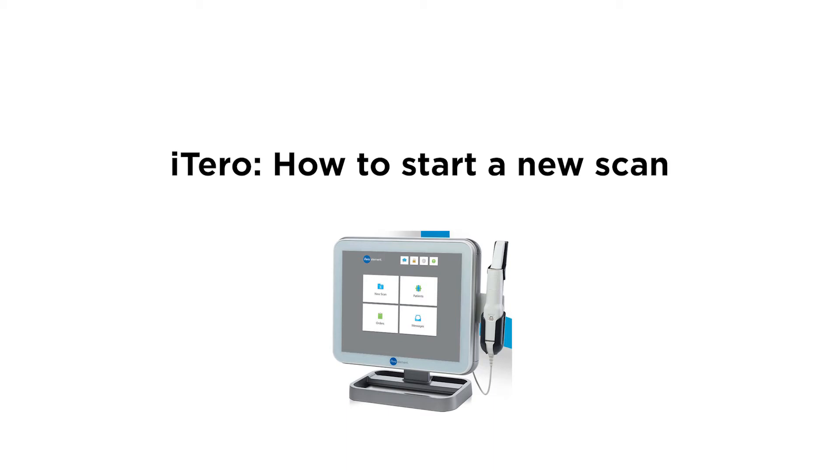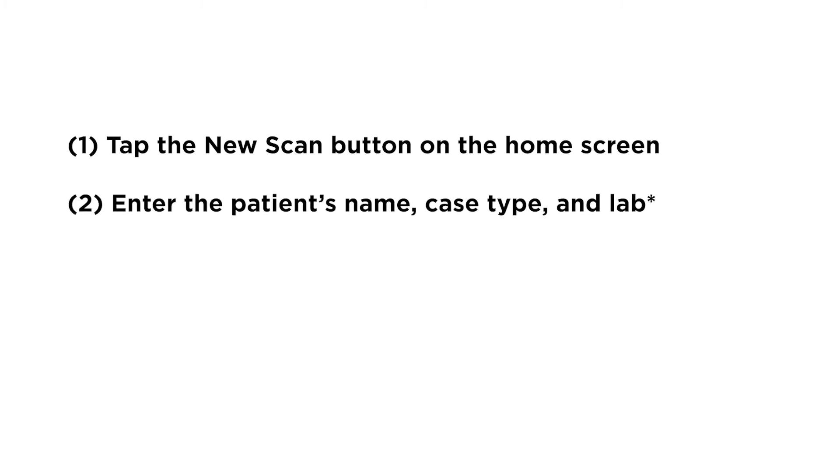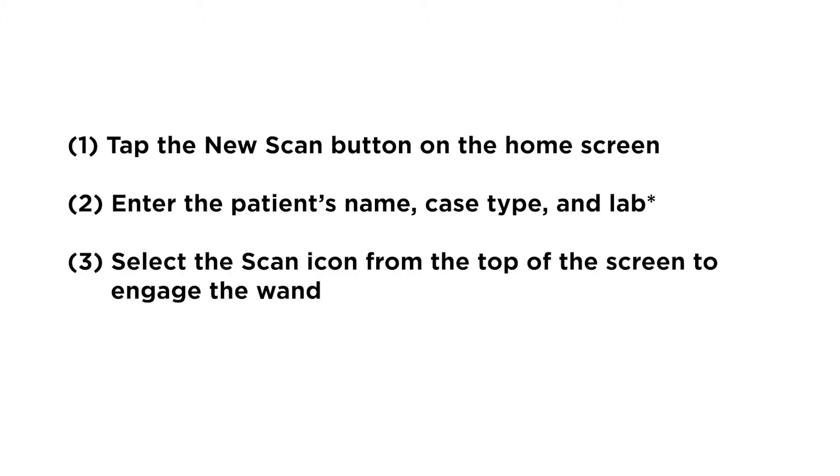Starting a new scan can be done in three simple steps. First, tap the new scan button on the home screen. Second, enter the patient's name, case type, and lab. Finally, select the scan icon from the top of the screen to engage the wand.